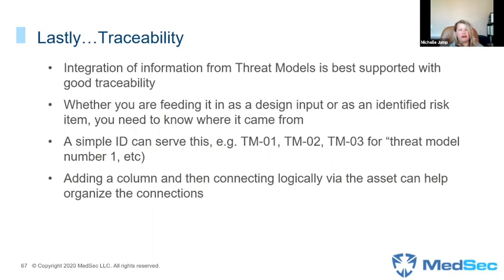That can get hard if you don't have the same approach, in my opinion, for what it's worth. If you don't do an asset-oriented threat model and an asset-oriented risk management file, it's harder to keep those connections. It's not impossible, but from the integration work that I have done, I find it easier to approach them the same way. You'll see that I've called that out in a couple of different places, like in the attack trees too. You have attack tree IDs that can be integrated into the different points in the attack trees.